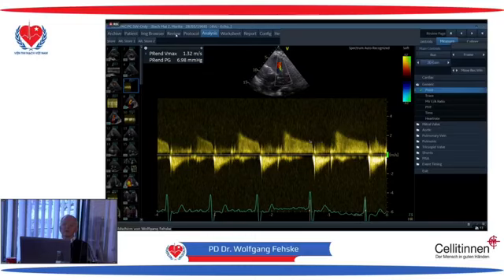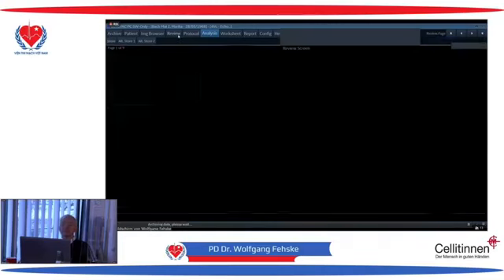We go looking, first of all, we look now for the ASD itself. Can you translate? Yes.